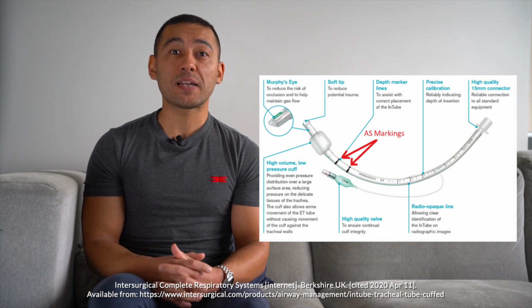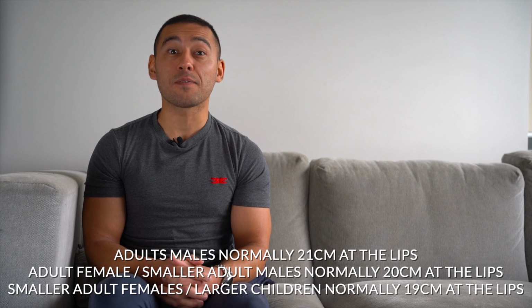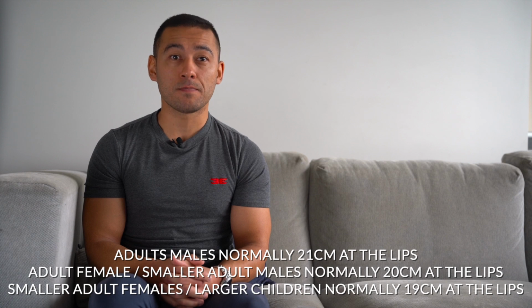Remove the laryngoscope and maintain a firm grip on the tube. This is also a good time to verbalize length at lips. While holding the tube in its position, ask an assistant to pull the stylet out and inflate the cuff. Ask your assistant to then begin ventilating to confirm a tracheal waveform. Once confirmed, you can secure it with a tube tie.